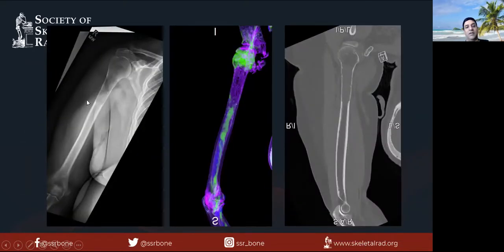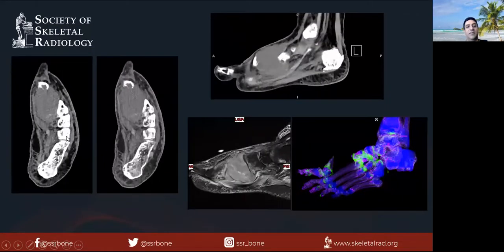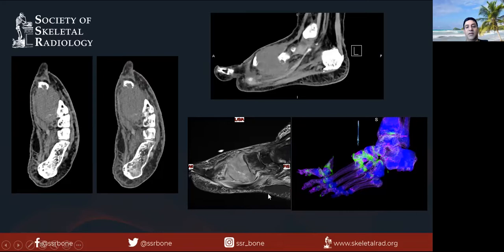You can also see other lesions. In this case there's a subtle lesion in the humerus showing a purple color with edema around it — indicating an aggressive lesion such as metastasis thinning the cortex, or myeloma, with surrounding edema. This edema is very similar to what you see on MRI. Here's a large synovial sarcoma on the foot with bone destruction, and bone marrow edema is visible both on MRI and on CT in the navicular, cuneiform, and base of the metatarsal eroded by the mass lesion.